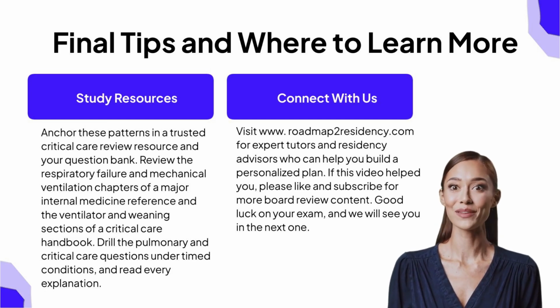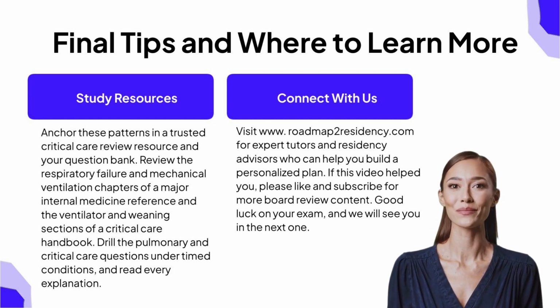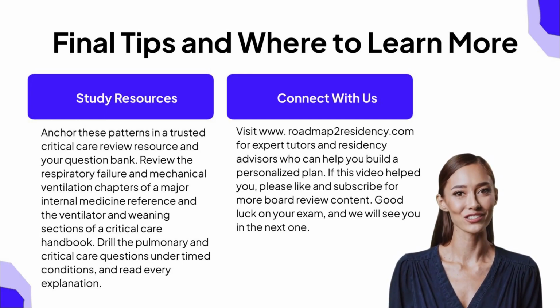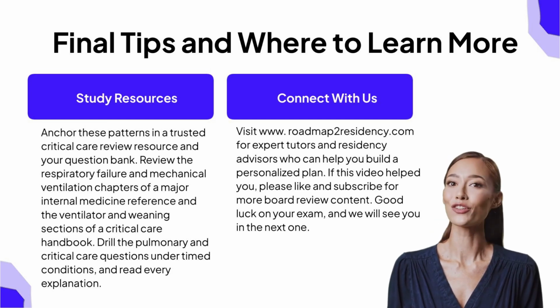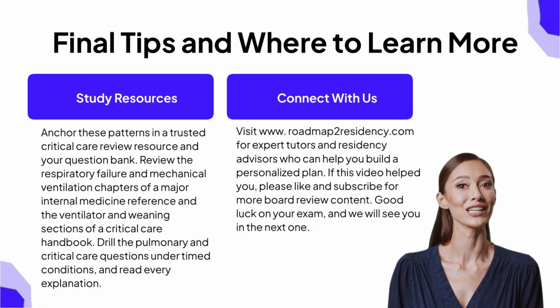For settings, split the blood gas into an oxygen problem or a carbon dioxide problem, then turn the matching pair of knobs, and always protect the lung in acute respiratory distress syndrome with low tidal volume. For weaning, look for the patient who is awake, on minimal settings, with a strong cough, who passes a spontaneous breathing trial and then extubate. And remember the 2 traps. Do not be fooled by the reassuring number, and do not reach for the overkill answer.